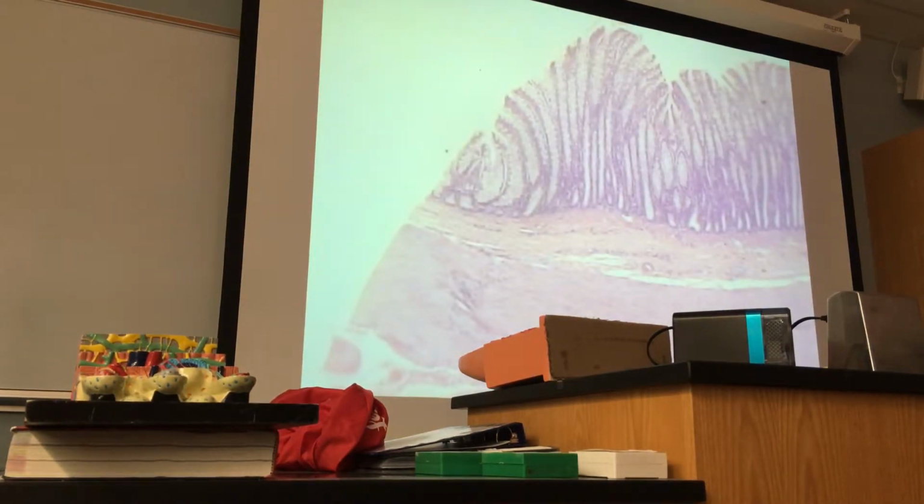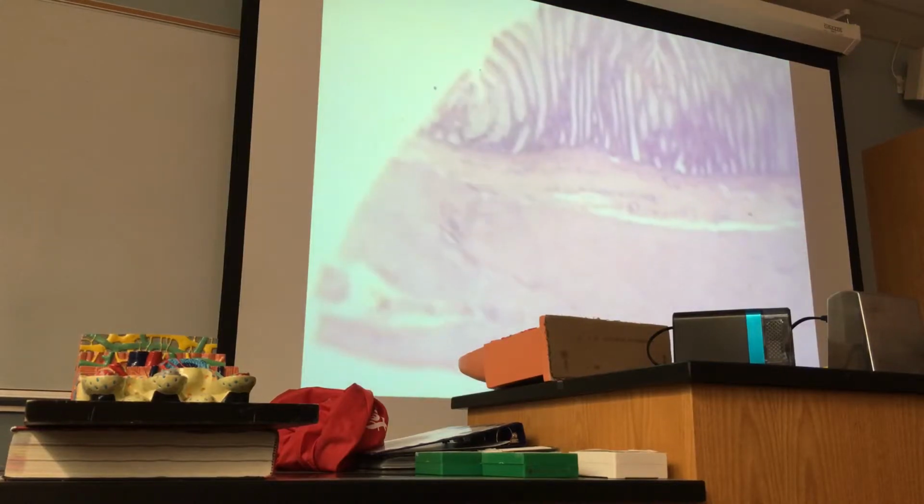Slide on large intestine. And like any part of GI tract, you will see all the 4 different layers.